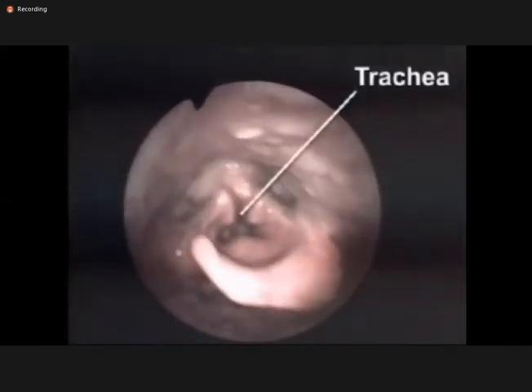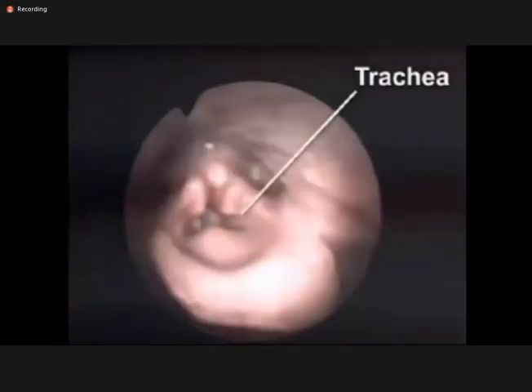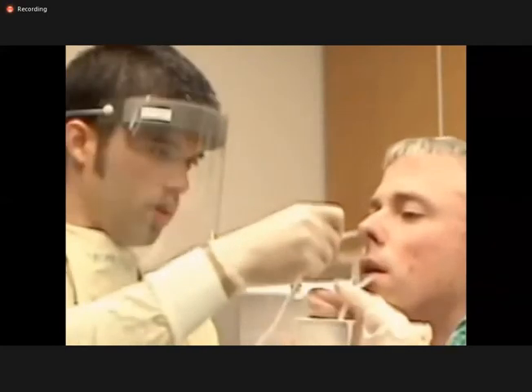Note that in this endoscopic view of the larynx, the trachea is frequently open and may be accidentally intubated with an NG tube. Note also that as the patient swallows, the laryngeal apparatus rises and the epiglottis covers the glottis, preventing tracheal entry. Once past the larynx, the tube may be inserted. Check the black markings on the tube to confirm proper depth of insertion.